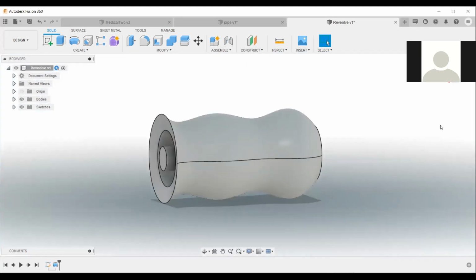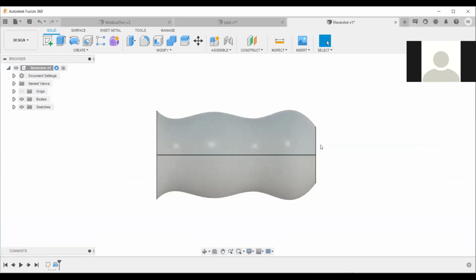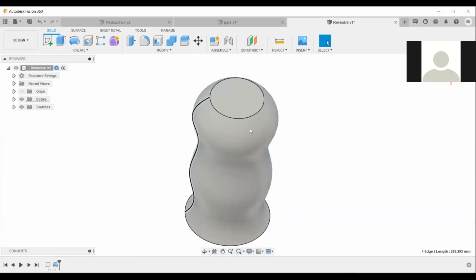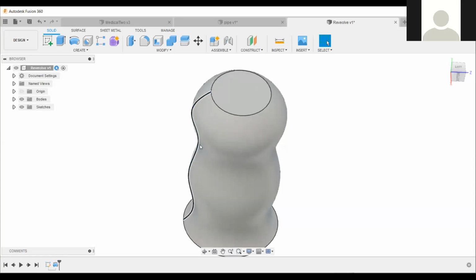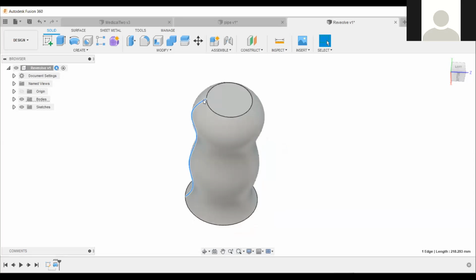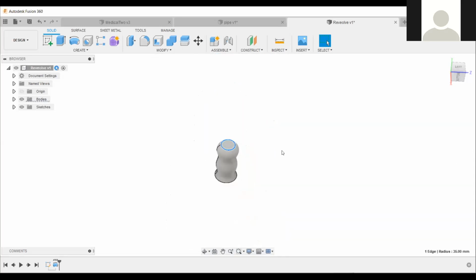That line will always be there. There's a line there. It will always be there. Yes, no, it will not always be there. What happened? I don't know why it's showing it. It should not be there. Can you try? Yours brings this line, mine brings a line. I don't know why. But you are rotating around it. It was just the profile. Okay. Anyone else?